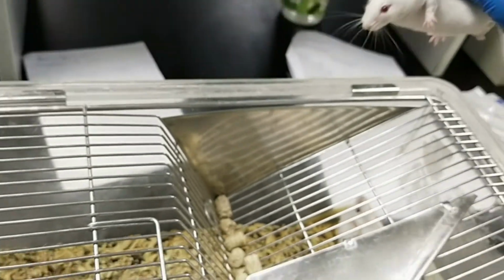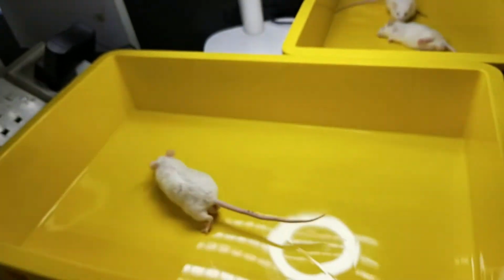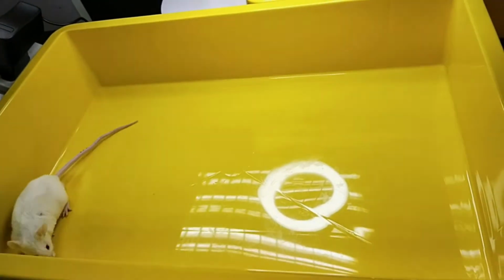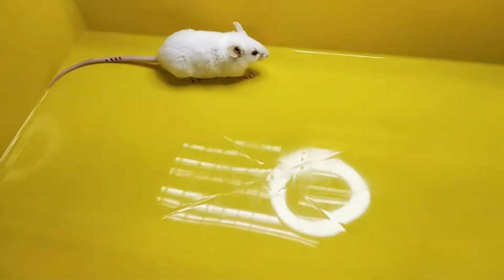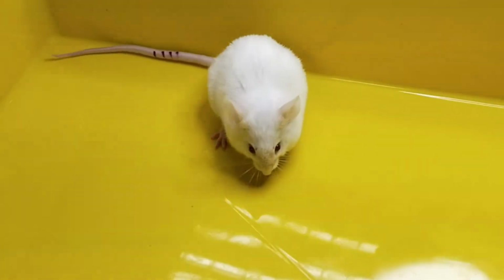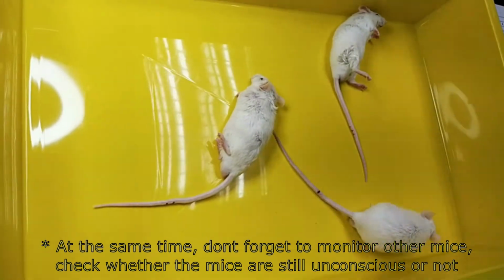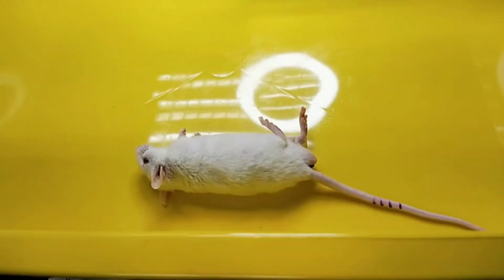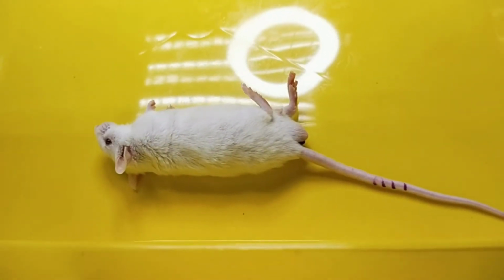So after injection, we need to transfer the animal into the tray, and we need to observe the animal to see if the animal is losing their reflex. So this is for the mice number 4 for the IP injection.